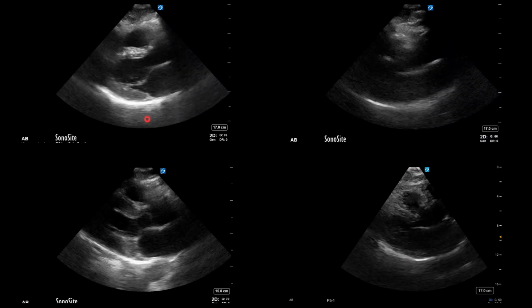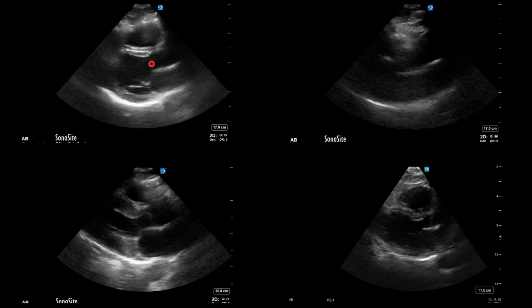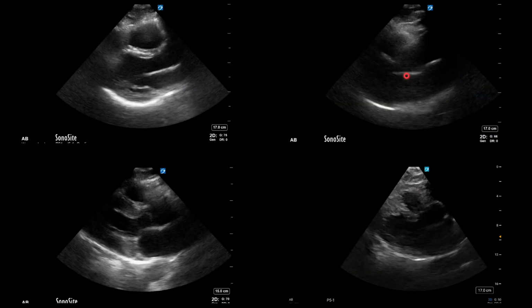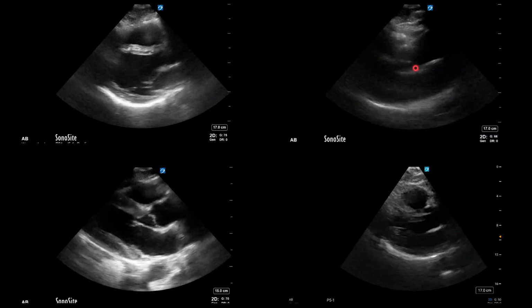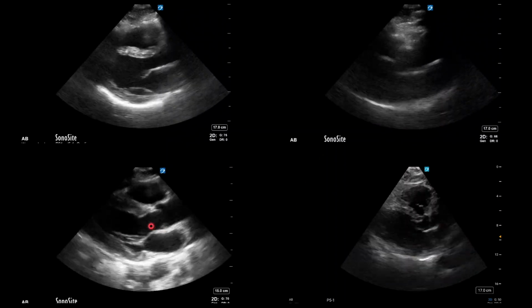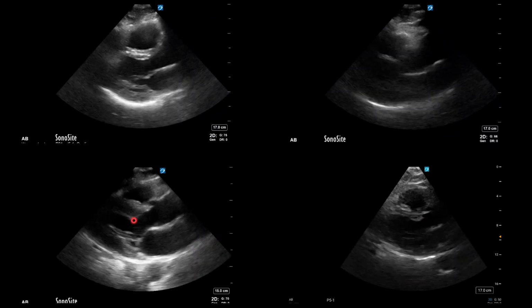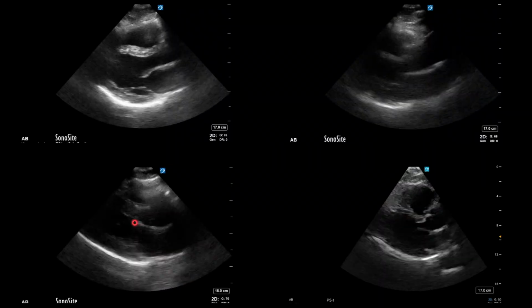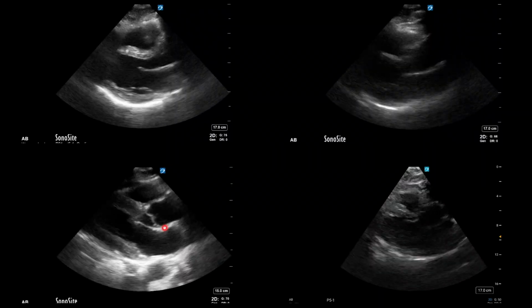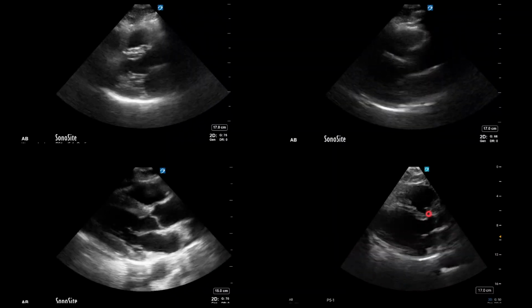Let me show you some examples. In this patient, the left ventricular outflow tract looks pretty good, it's cylindrical. However, if you look here, it's not a very good picture, and also the left ventricular outflow tract has a conical shape. In this patient, however, the interventricular septum is very thick, and also there is a bit of a sigmoid shape pattern in the interventricular septum. So it's not a cylindrical shape either. And of course, this one has a pretty obviously sigmoid shaped interventricular septum.